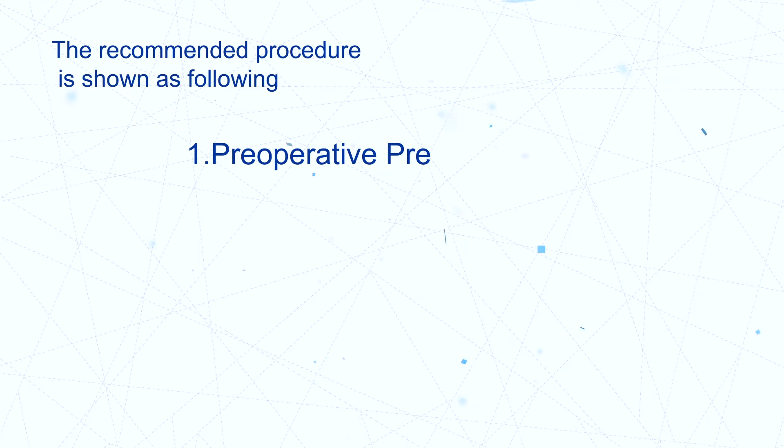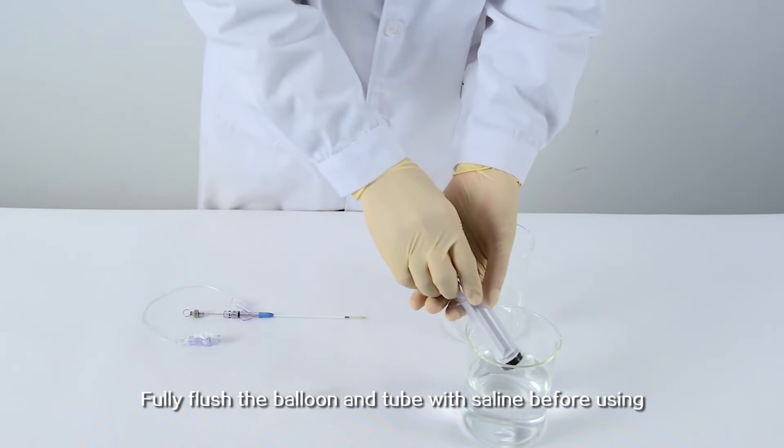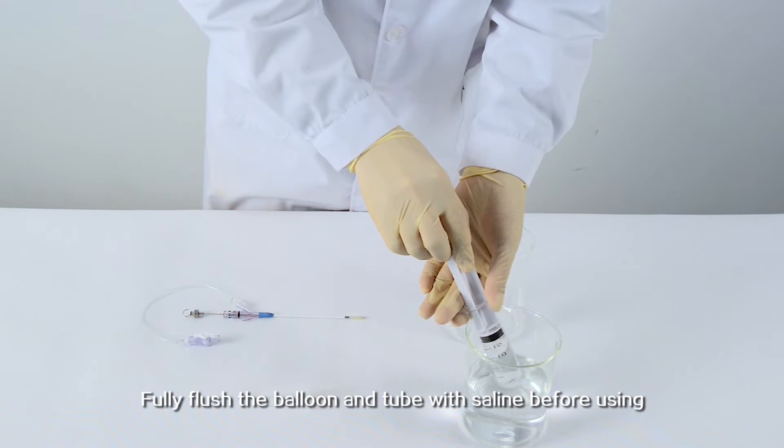Step 1: Preoperative Preparation. Fully flush the balloon and tube with saline before using.